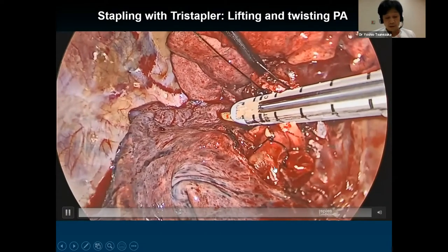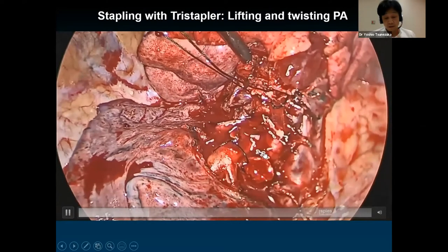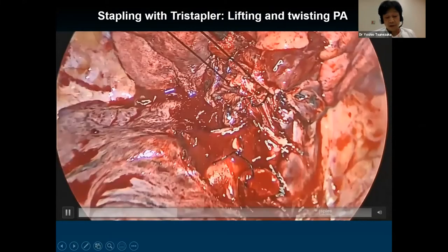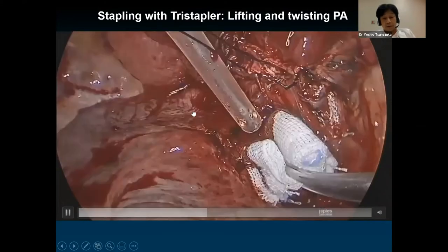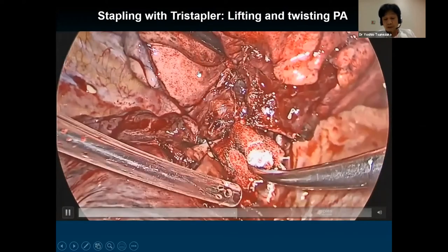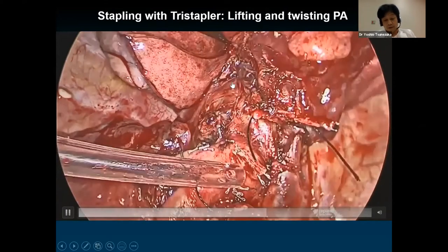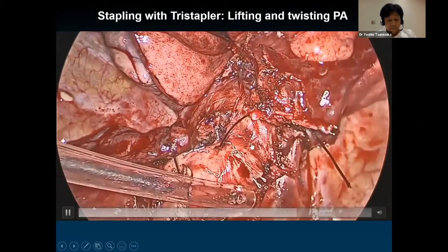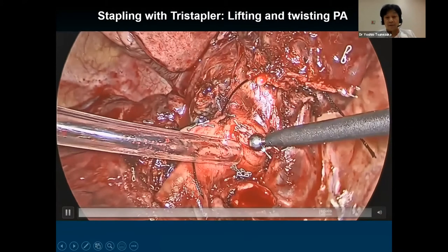Major bleeding was caused by the stapling itself at the end of stapling. But I think the surgical stapling technique may cause this. I want to draw your attention to the bleeding site. You can see a tear near the staple. Seeing the case, some surgeons complain that the stapler is terrible by itself, but I think that the surgeon's skill is the problem. Thus, bleeding is a matter of course, and the surgeon should reflect on this result.